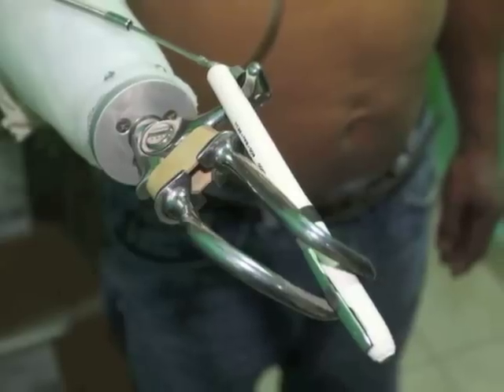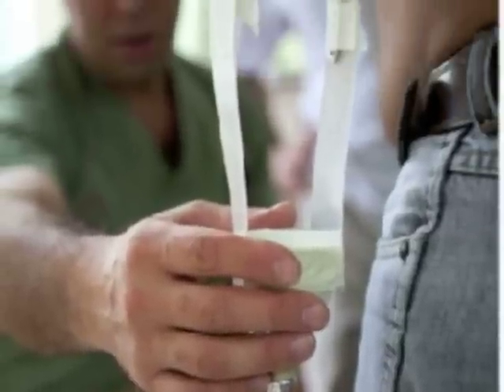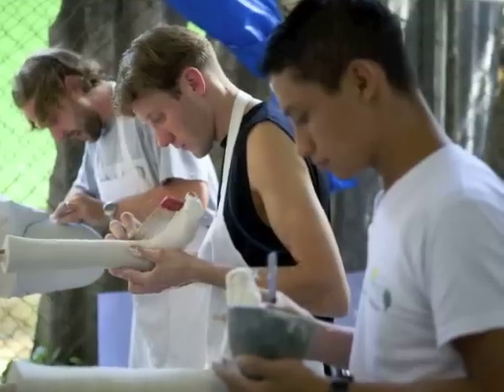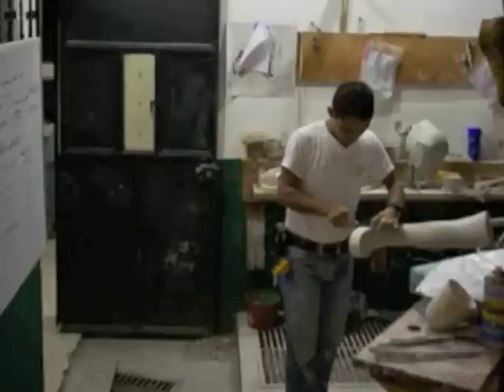Presently, donated and surplus prostheses are refurbished by local staff to provide low-cost solutions for hand amputees. The typical system is the cable-powered splinthook. The Guatemala team has dedicated and experienced staff, but their methods are resource-limited and hence very low-tech.